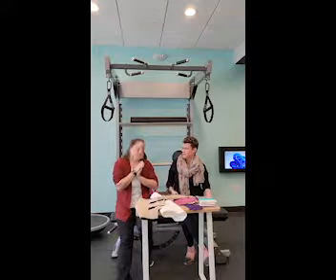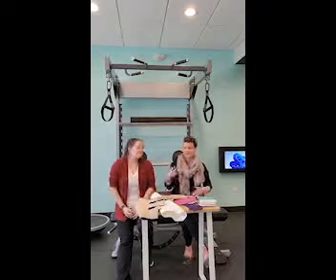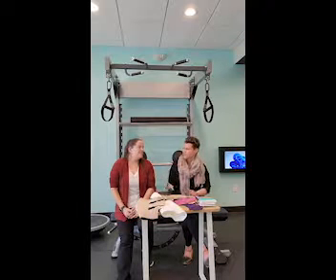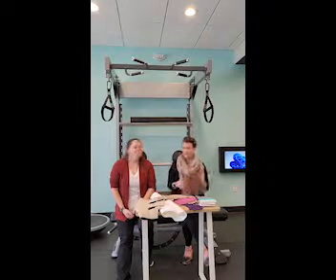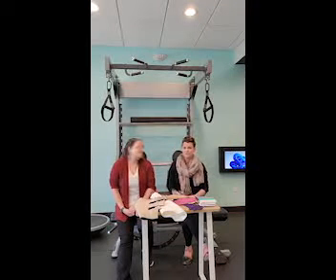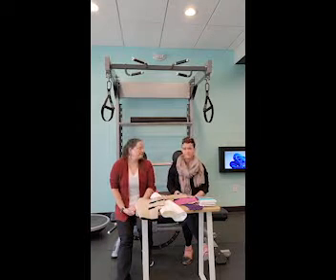Well, there's another factor here too, which is your lifestyle. Depending on what your day-to-day looks like, if you're outside doing a lot of really active things and working really hard and you want a little extra protection, you may want a flat knit when you do those activities. And then have a dynamic for other, more low-key times. But that's something your therapist will be able to help you with and help you make those decisions.